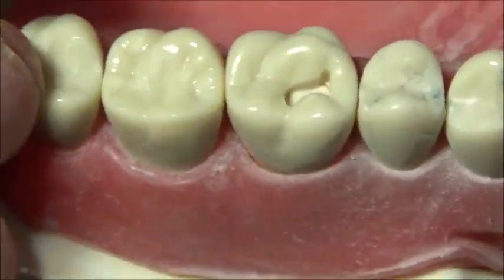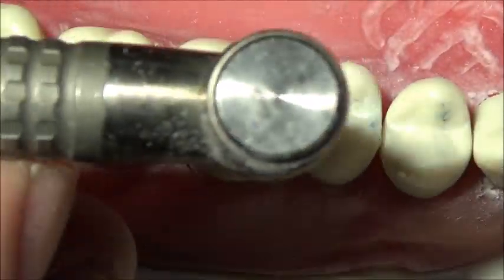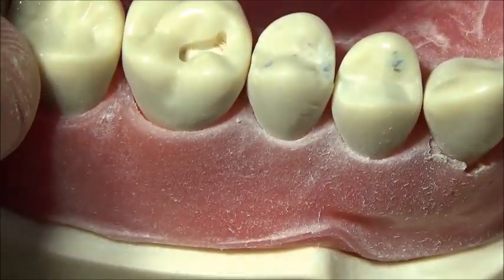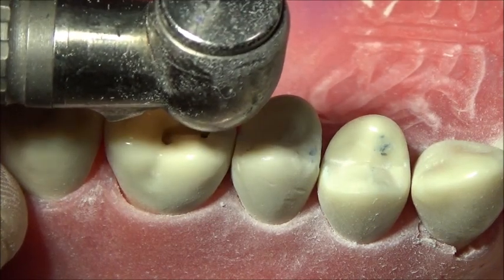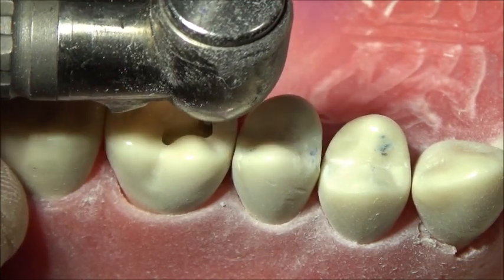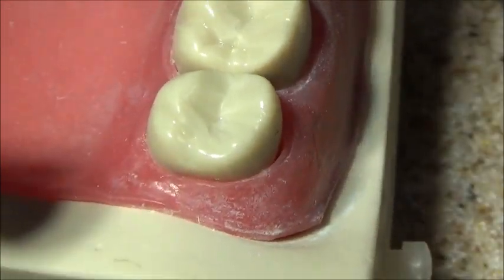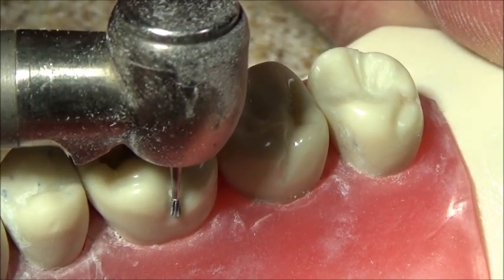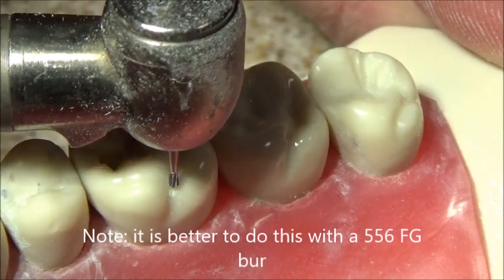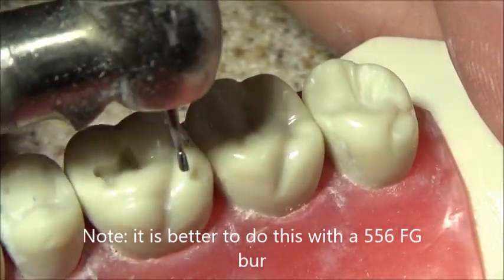Here we go. We'll go a little bit closer to the marginal ridge, sweeping back and forth. For the distal lingual groove, I'll actually turn a little bit like this. What I like to do is come in here and lay the burr kind of flat, go in about a millimeter and a half, and then come up and traverse the distal lingual groove. It's kind of hard to show based on the camera angulation, but we'll do our best.